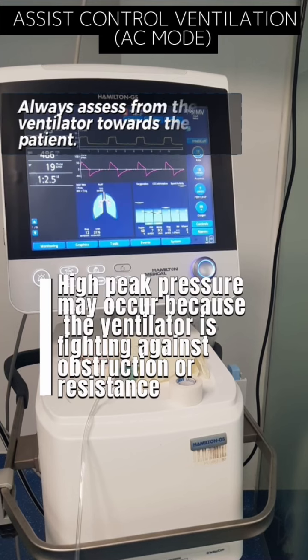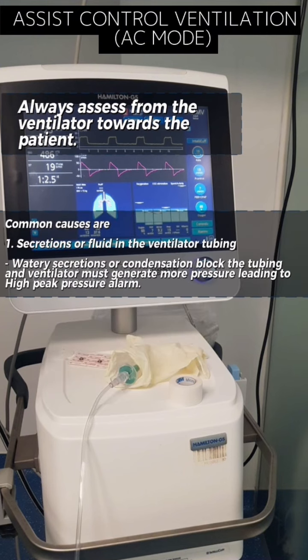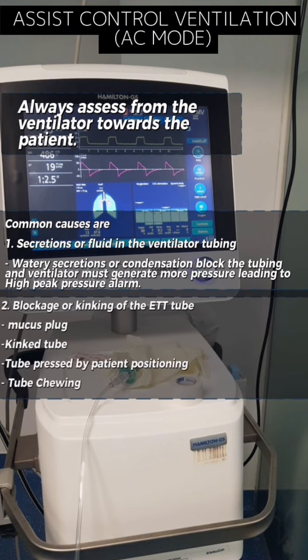Always assess from the ventilator towards the patient. High peak pressure may occur because the ventilator is fighting against obstruction or resistance. The common causes of obstruction or resistance are secretions or fluid in the ventilator tube, blockage or kinking of the ETT tube, patient chewing the ETT tube, bronchospasm or airway narrowing, and thick secretions in the patient's respiratory airway. So we have to look for all these essential signs in AC mode.